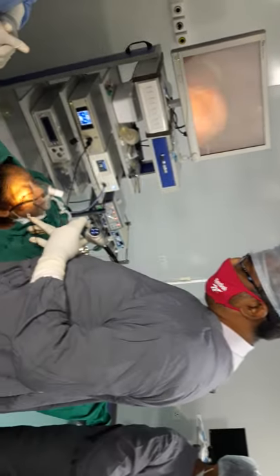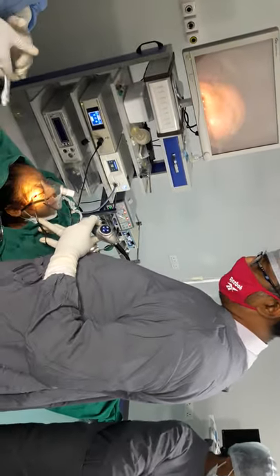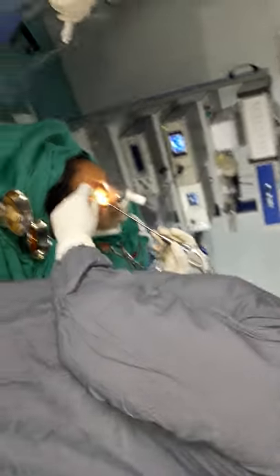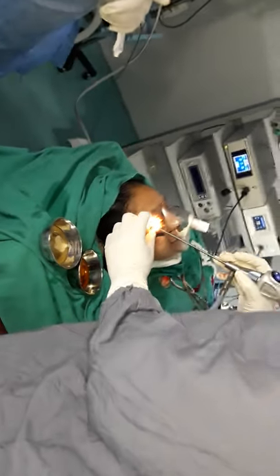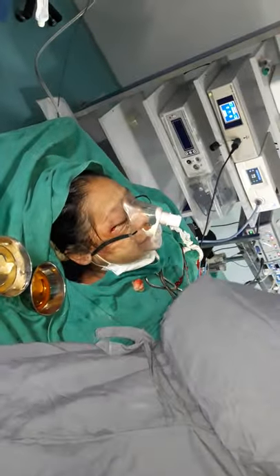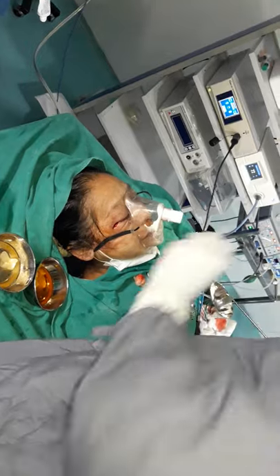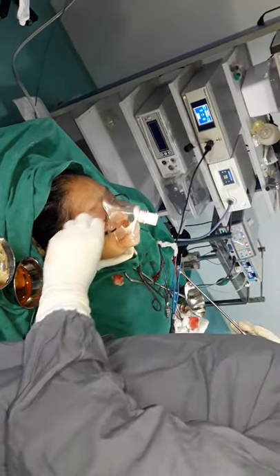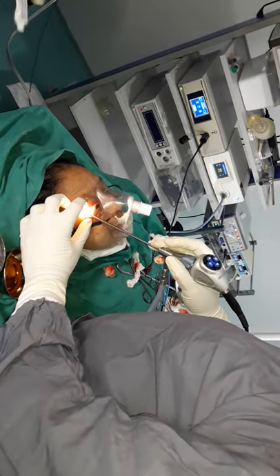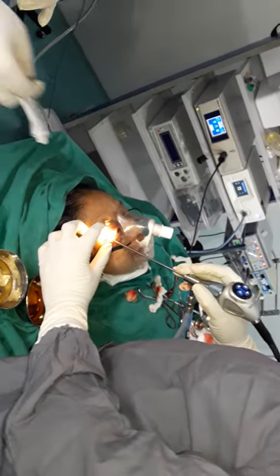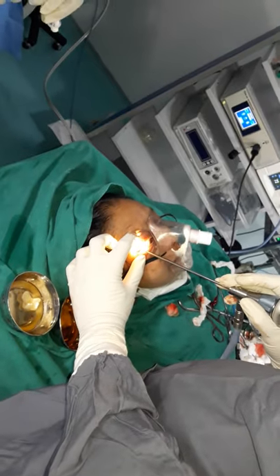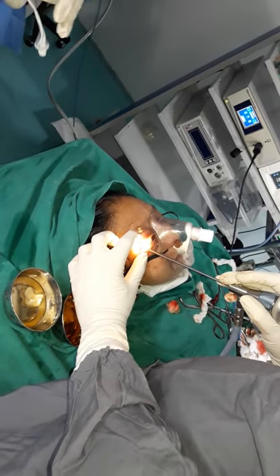Here I have done Canthotomy and Cantholysis. See the fat prolapse — that is the perfect way of doing the Canthotomy and Cantholysis.